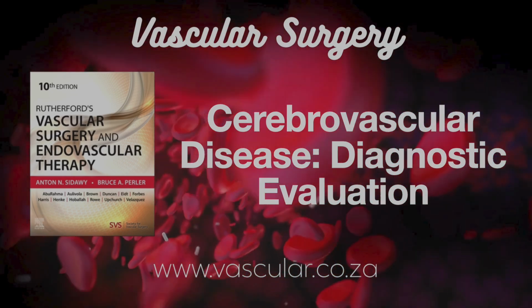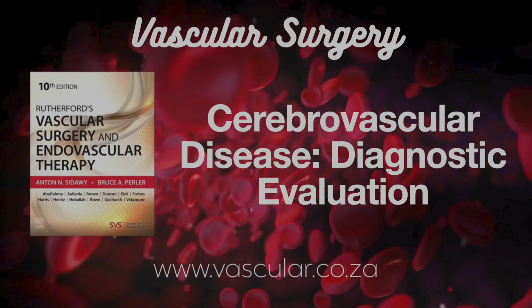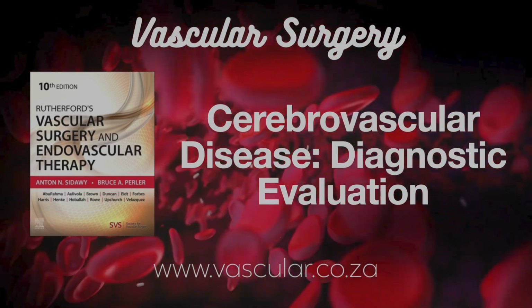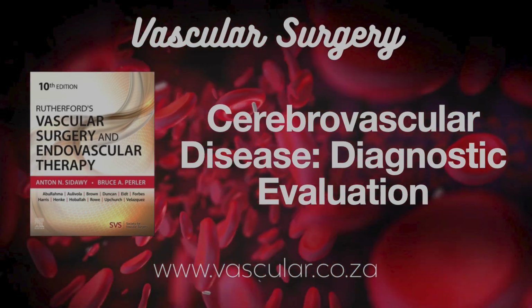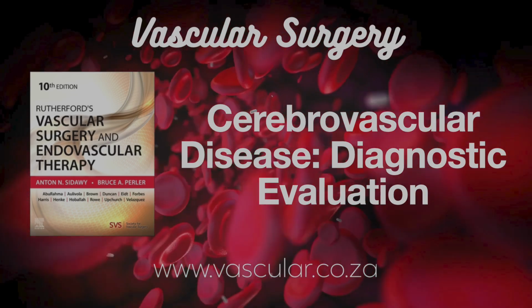The standard is the NASCET method from the big North American trial. You measure the diameter of the artery at its narrowest point, the residual lumen, and you compare that to the diameter of the normal, healthy internal carotid artery just a bit further downstream, beyond the stenosis. It's a ratio, and often they take pictures from several different angles to get the most accurate view. Okay, so it's very precise.